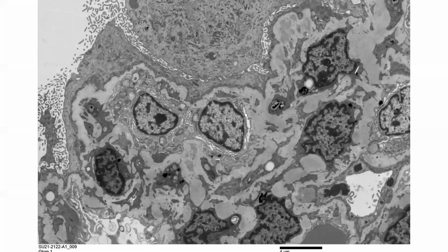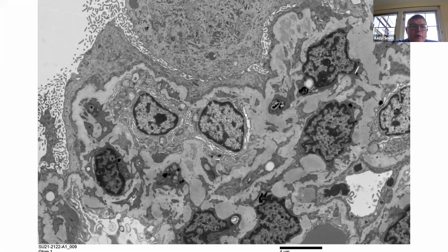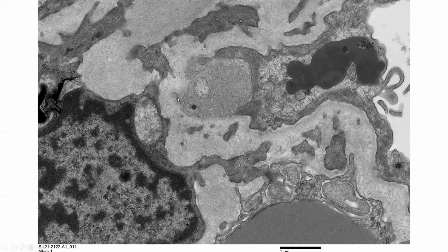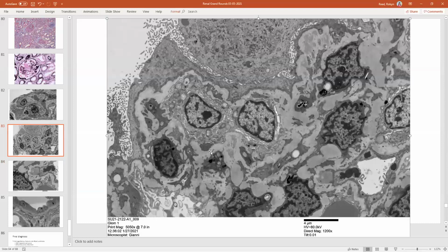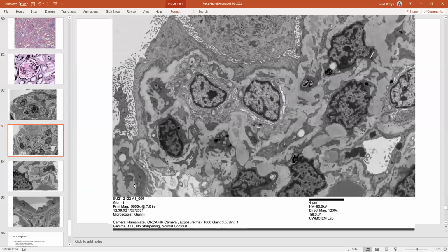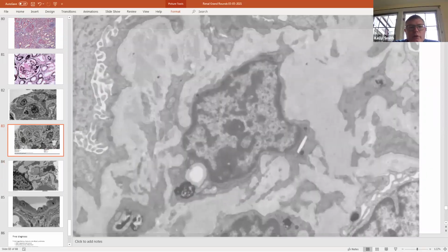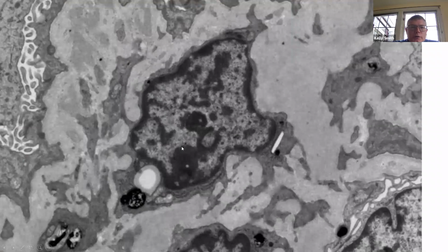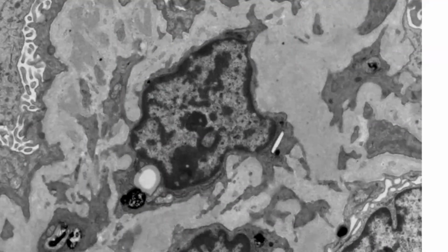That's fascinating. The higher magnification picture of that one deposit looks more like cell debris, and so I think with all the injury going on, I wouldn't hold my breath. Yeah, this looks like cell debris for sure. But that other one, I'm going to go back and try and make it bigger in the PowerPoint. Let's see if it'll behave for me. And you can get crescentic glomerulonephritis with Alports and no other potential cause. So yeah, it's reasonable. Well, maybe I'll try some immunoperoxidase immunoglobulin stainings since I've got the material for that. And certainly if we see any evidence of recurrence in the graft, that would sort of up the ante in terms of going back and characterizing what was happening in the native kidney.